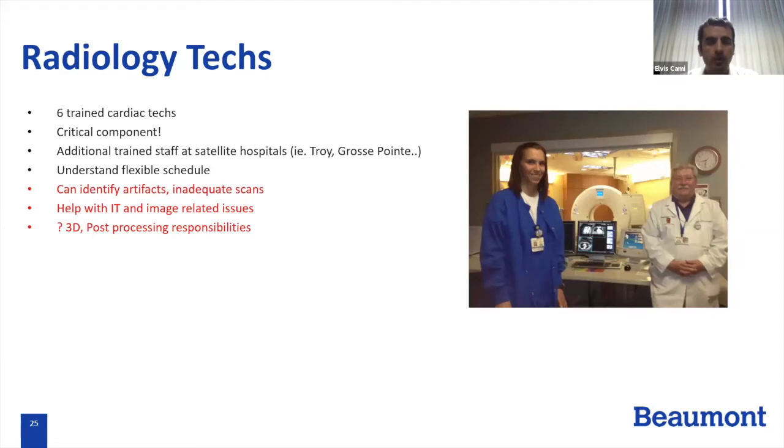Our techs, so currently we have six technologists that are cardiac trained, and they are dedicated to working on that specific scanner. Almost all of our cardiac CTs are done on a Siemens Flash. It's a dual source Flash scanner. It is not a dedicated cardiac scanner in the sense that if there's a PE only study or an aorta only study, they can happen on that same scanner as well. But all of the cardiacs will happen here.